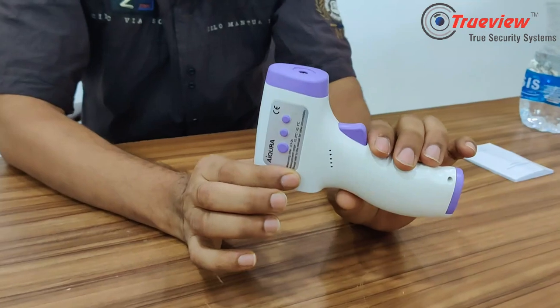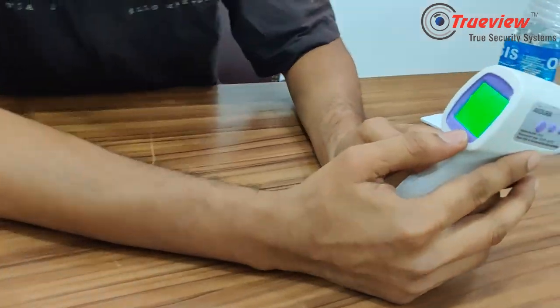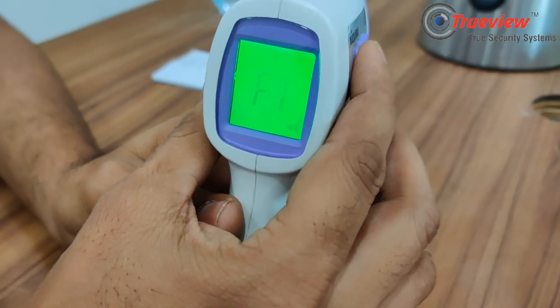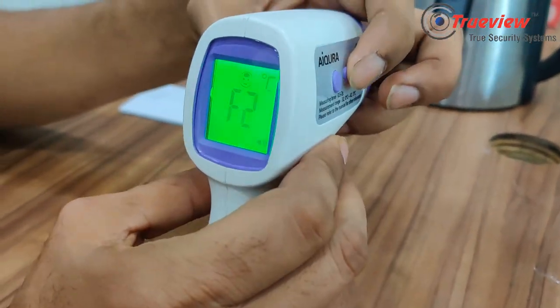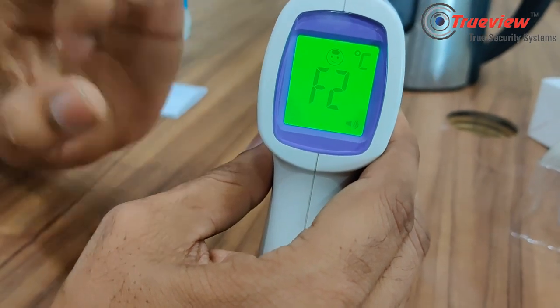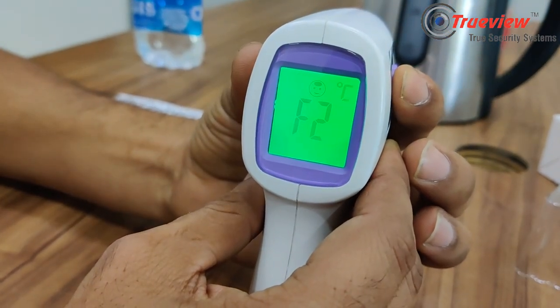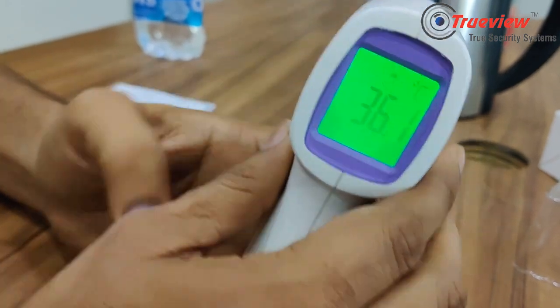You can use this device with or without audio. If you don't need the beep sound, you can change it. To change the beep, press and hold the button. Now the beep is turned off — it's no longer beeping.